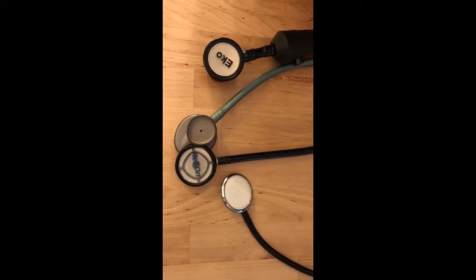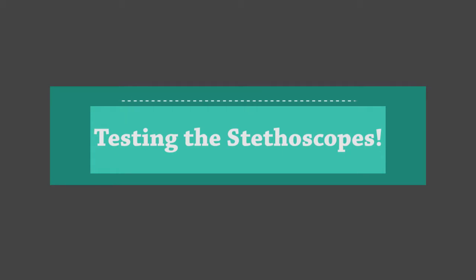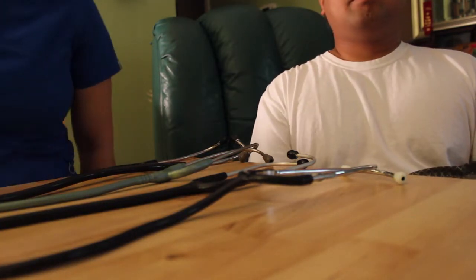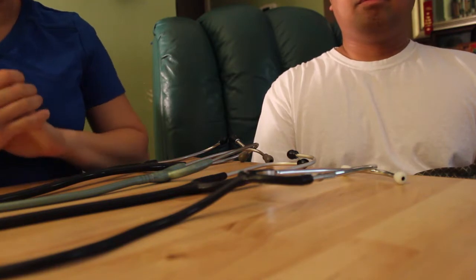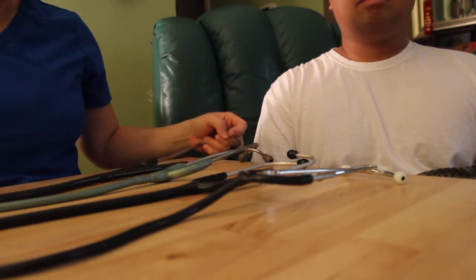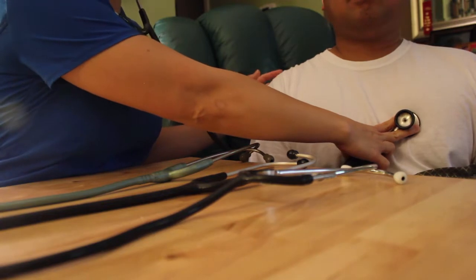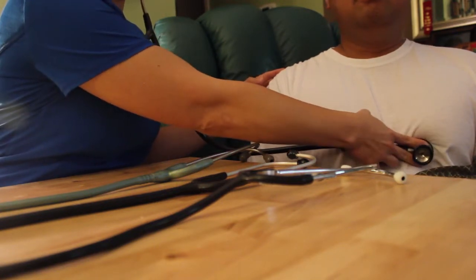Now we're going to check the accuracy and sound quality when used on a patient. I have a patient here for the test. Using the Echo Core first in analog mode — I can hear the sound, it's loud with less noise — actually there's no noise at all.